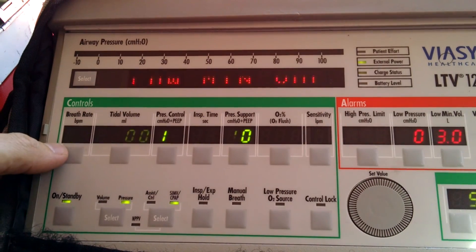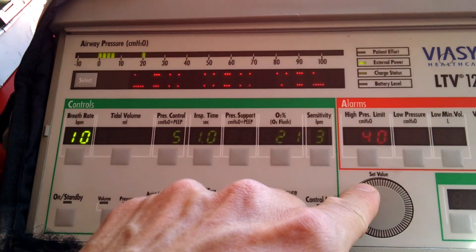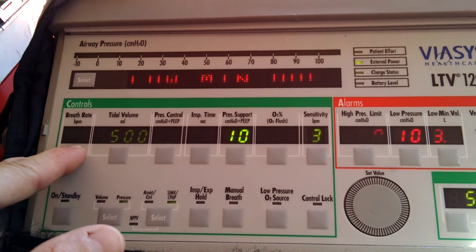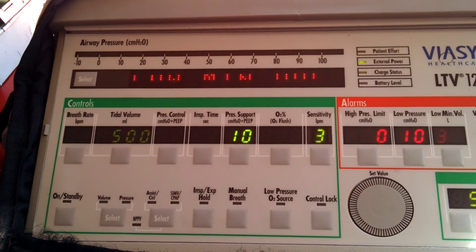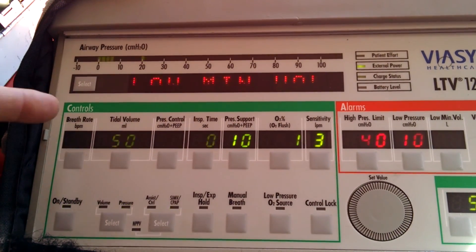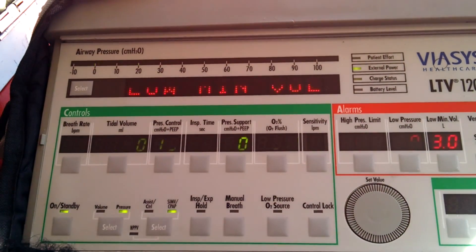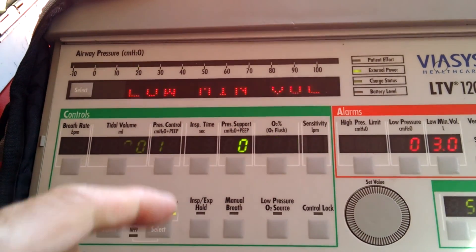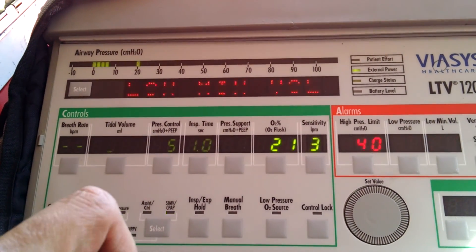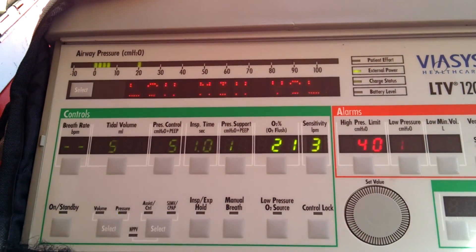You can take the breath rate down to nothing if you want, because the patient should be breathing on their own. The apnea alarm will still sound under 12 breaths per minute, and you can set a backup rate if you want. It's not necessary to set a tidal volume. The patient is now in BiPAP using the SIMV CPAP mode of the ventilator.